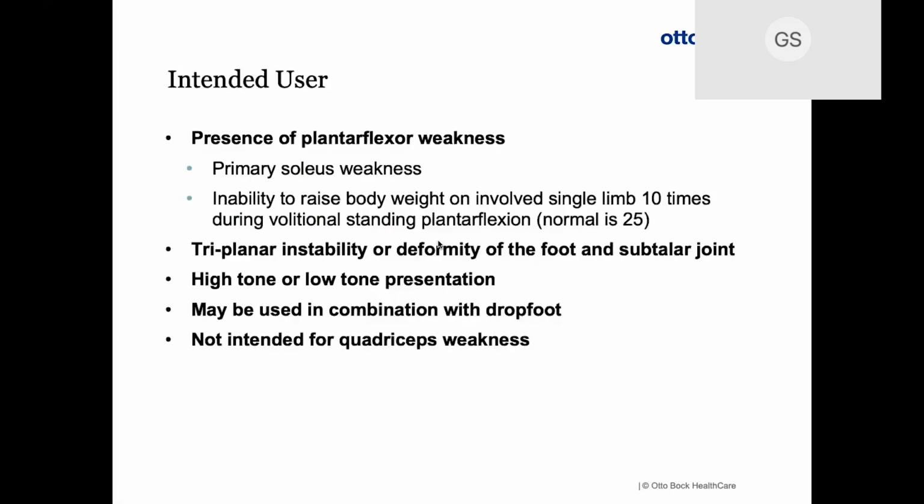Again, this is intended for people with plantar flexor weakness, primary soleus weakness. And what is that defined by? I had a prosthetist ask me this. What is soleus weakness? Because many times prosthetists, they don't care. They don't deal with that. But it's the inability to raise the body weight on the involved side 10 times during volitional standing.